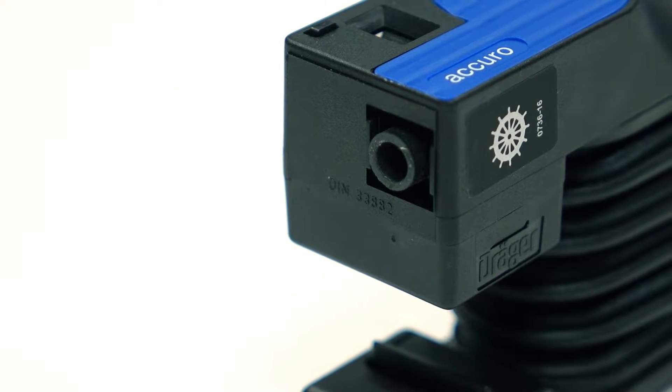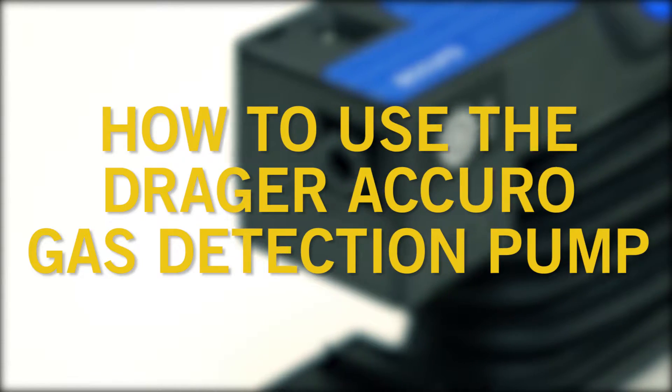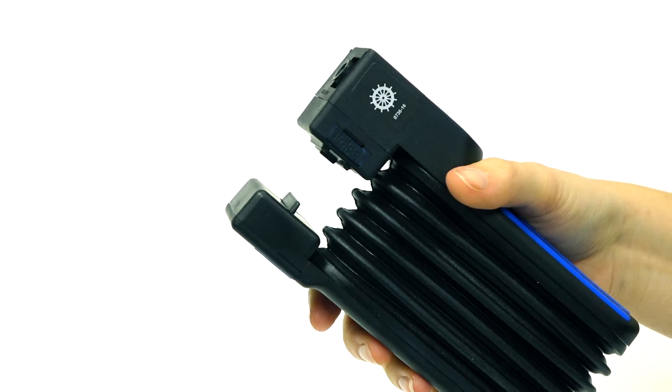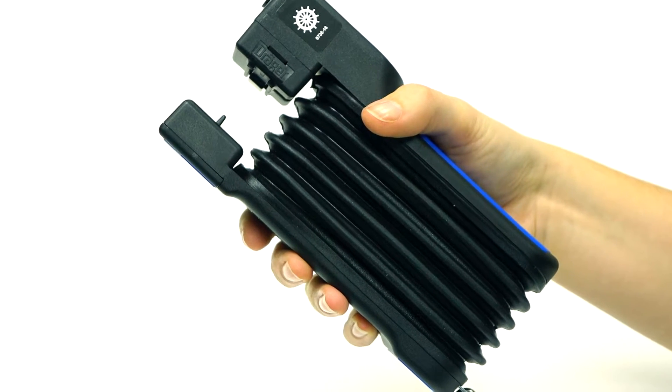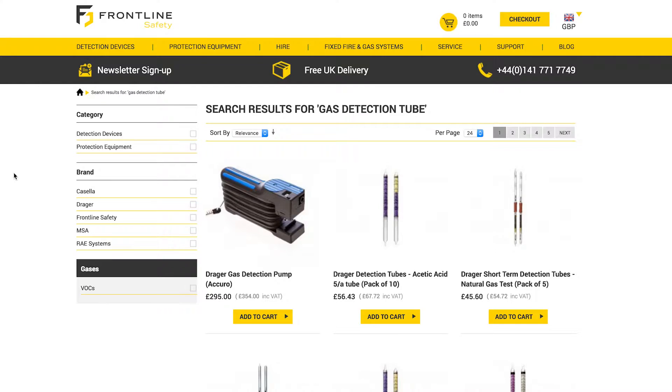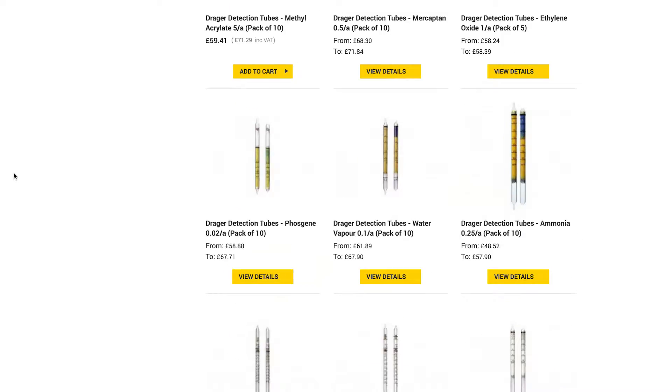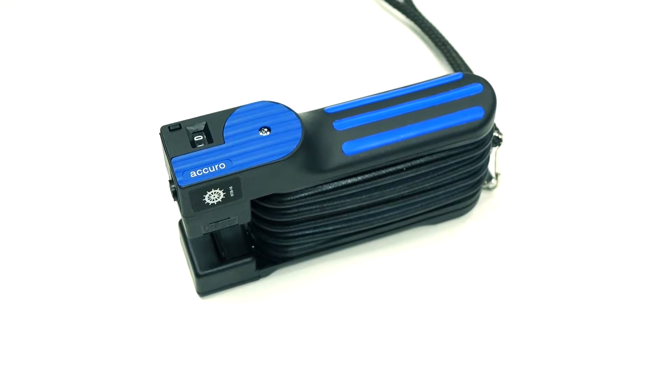In this video guide from Frontline Safety, we'll show you how to use the Draeger Acuro gas detection pump. This pump can be an easy and cost-effective method of gas detection. The pump is compatible with over 500 different short-term gas detection tubes and is suitable for many different applications.